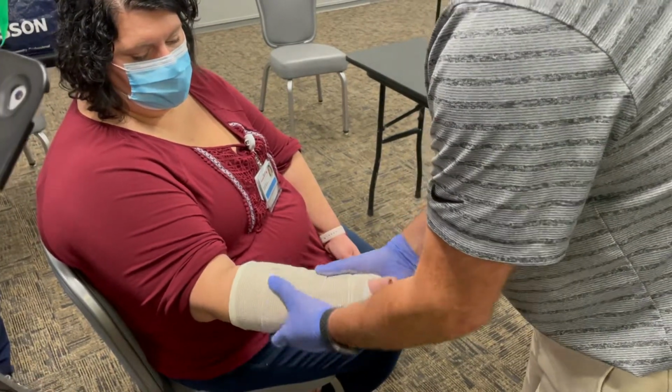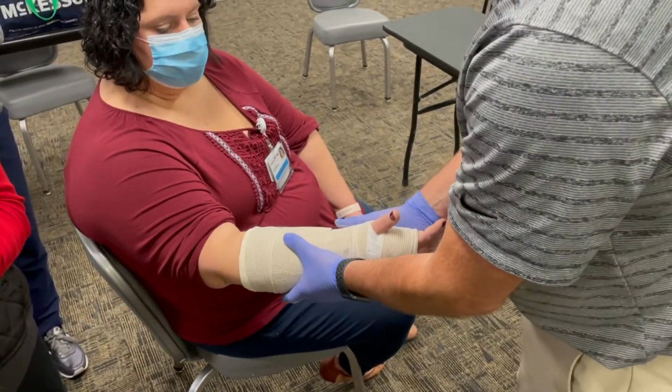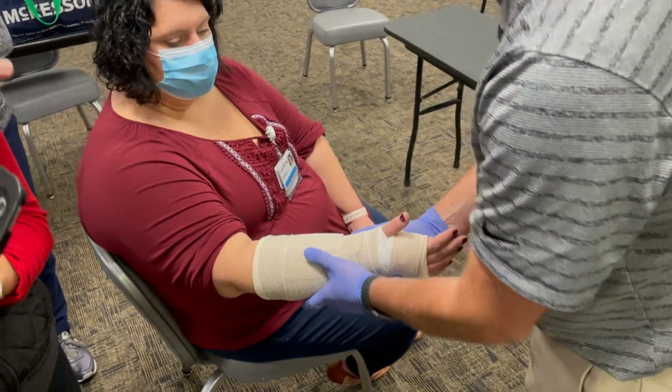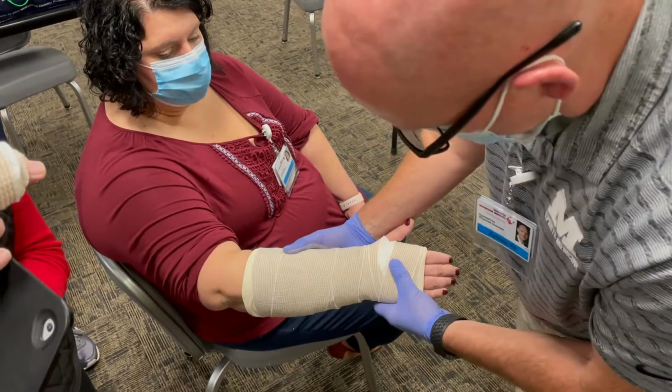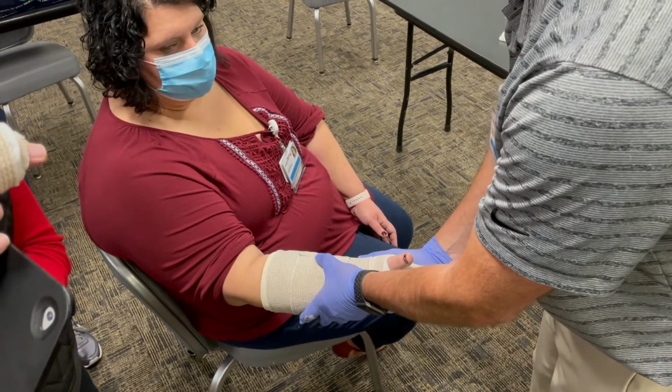Right. And now I'm going to start molding it now that I've got her done. A little bit of extension. Make sure she's not ulnar deviated or radial deviated. And just hold that while it hardens, and that's about it.